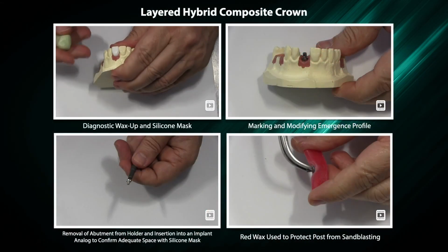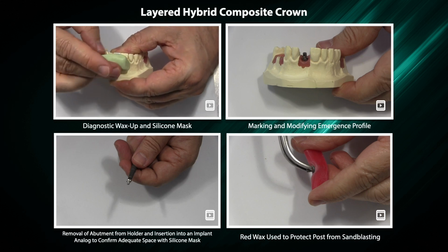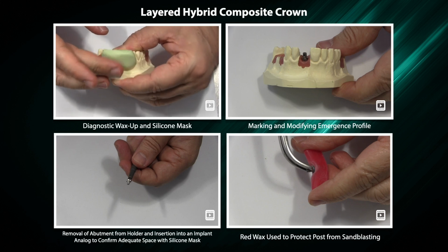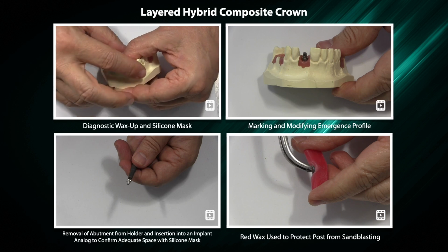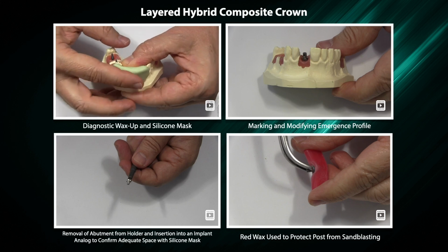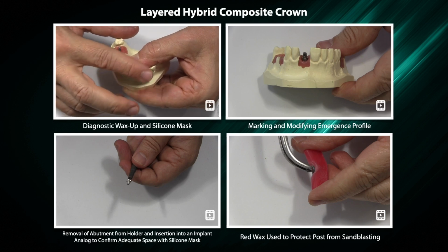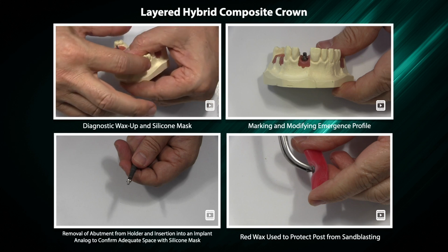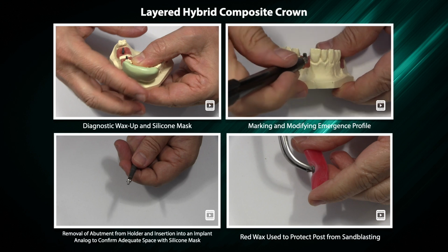Diagnostic: wax up and silicone mask. Marking and modifying emergence profile.